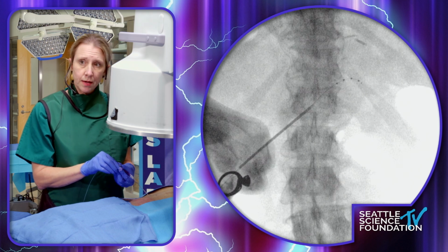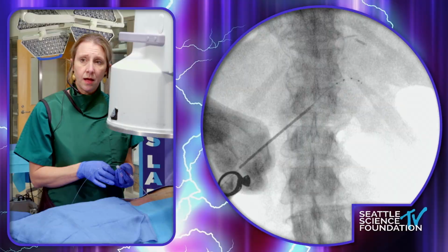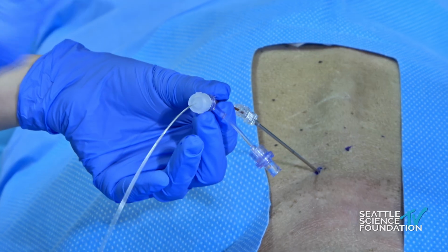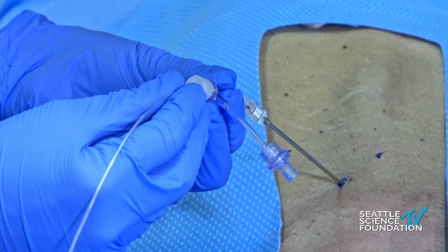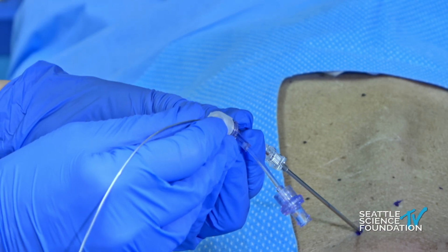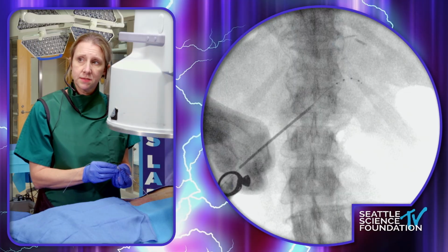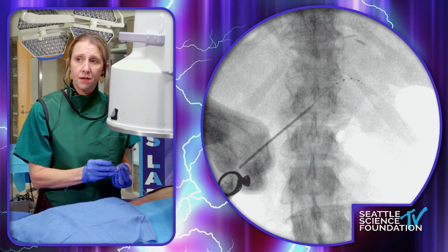So at this point, what you're going to see me do is unscrew the hub, which has secured against the introducer sheath. And now if you go back to the fluoroscopic view, please. While holding the lead in place, I'm going to withdraw the introducer sheath. Live.